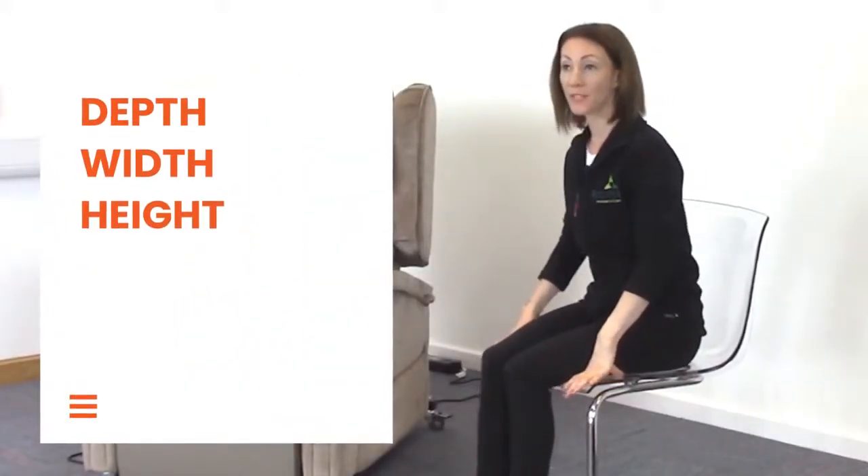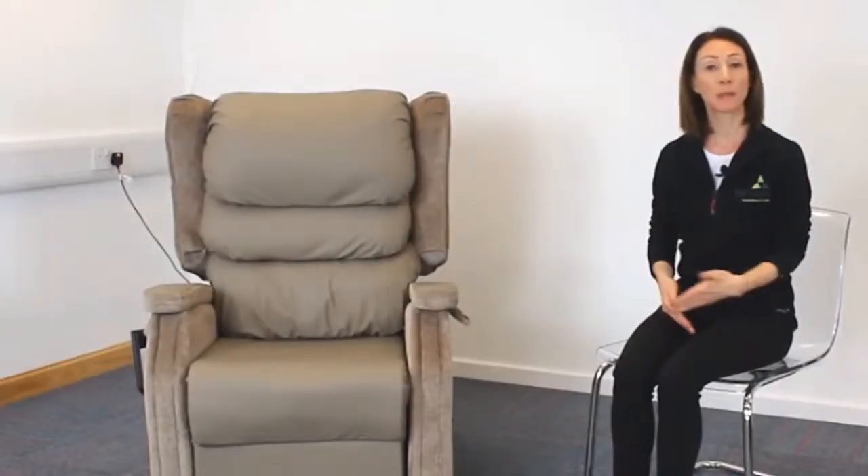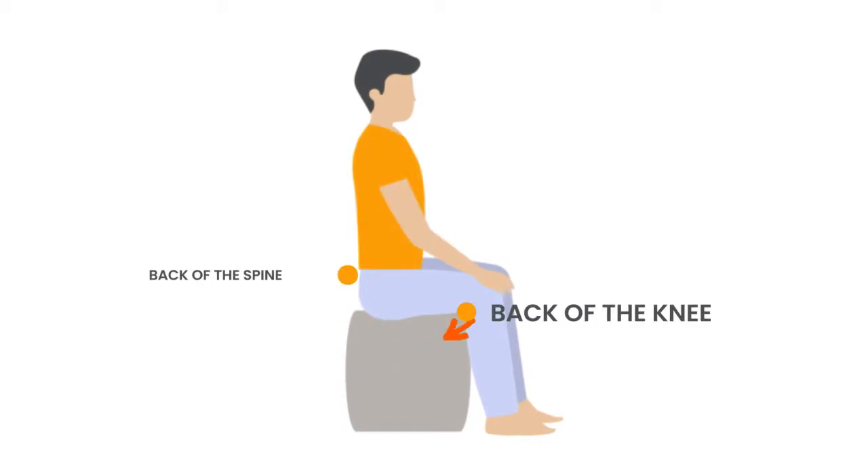In order to do that we need to take three key measurements. Ideally you want to sit somebody on a dining chair, which is much more accessible, and take the seat depth, the seat width, and the seat height. I always measure the seat depth first as I find this is the most crucial measurement in ensuring that the chair is the right size. I would measure from the back of the knee to the back of the spine for my seat depth.